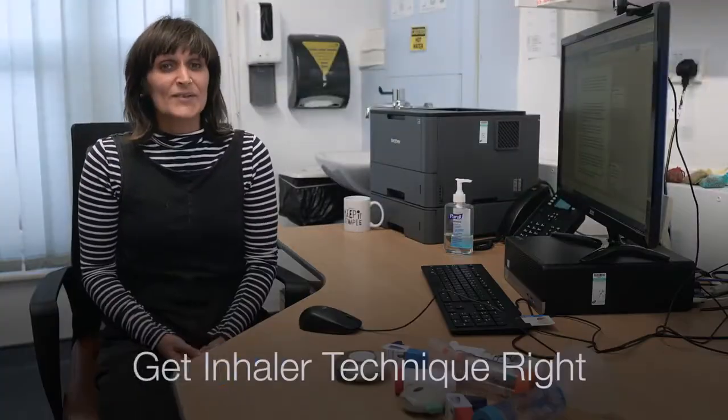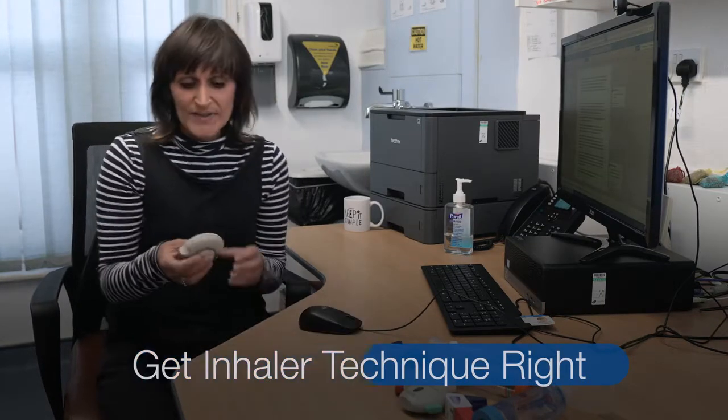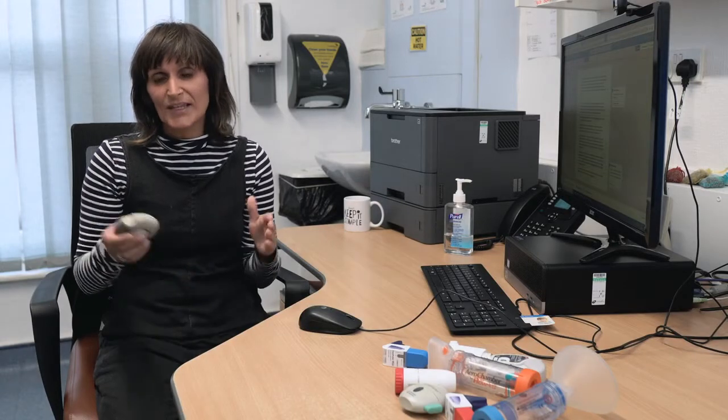When you do ask the patient to show you how to use their inhaler, it's really, really important that we see how they use their inhaler from start to finish. Activating an inhaler, compressing a lever, those parts of the process are just as important and critical in ensuring the person gets the most out of their inhaler as the inspiration part. By us knowing ourselves how we use the inhaler from start to finish, we can demonstrate, but we can also assess if the person is able to use the inhaler from start to finish. And that's really, really critical.